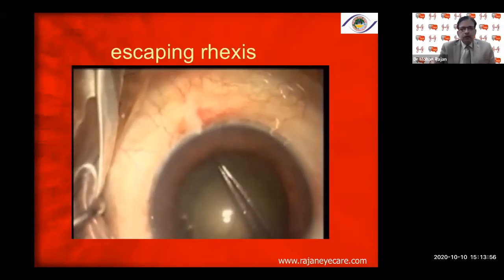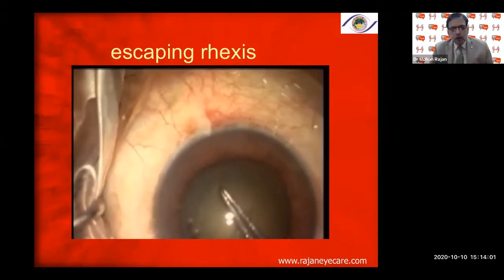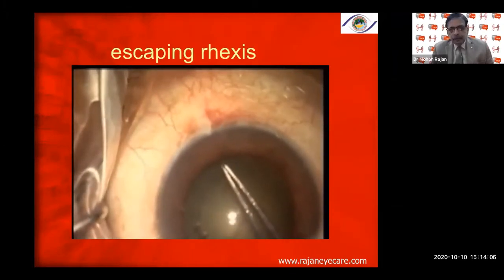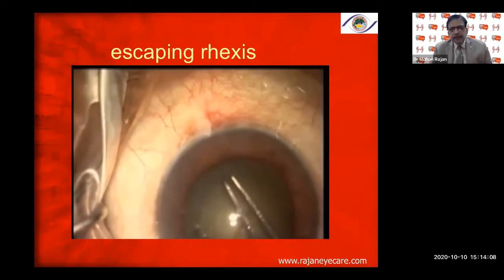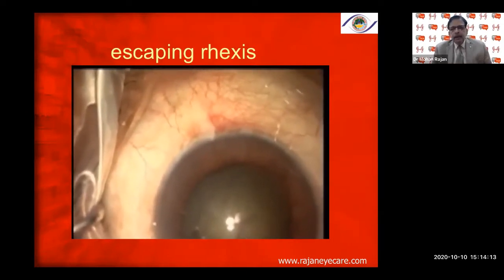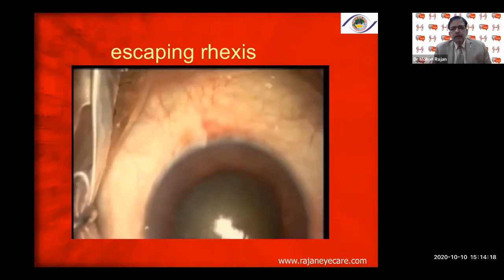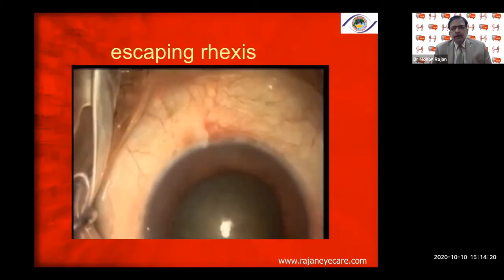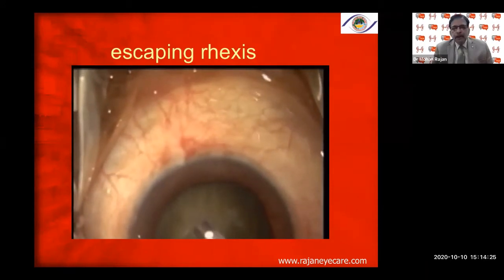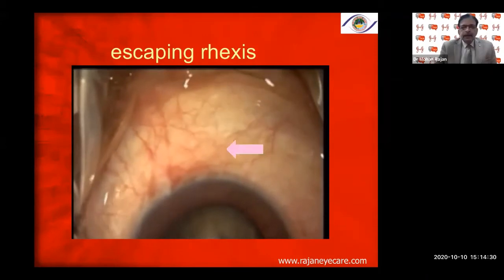When the rhexis escapes to the periphery in the zonular area, you have absolutely no control. Here the rhexis has gone to the periphery — I inject viscoelastic, then a viscoelastic like Viscoat goes and stays there, and I try to pull it towards the center. Always the pull must be towards the center, towards the center of the pupil — what we call centripetal.